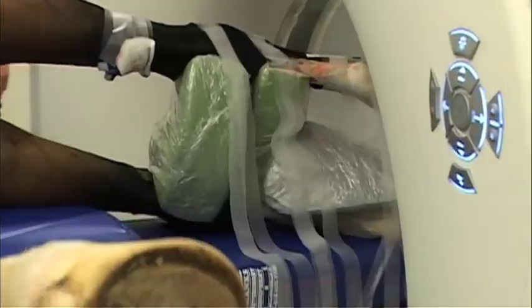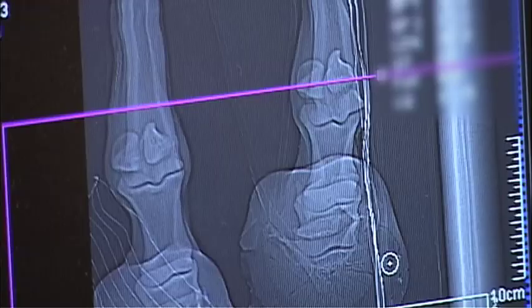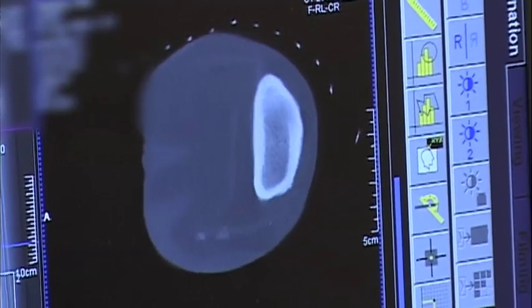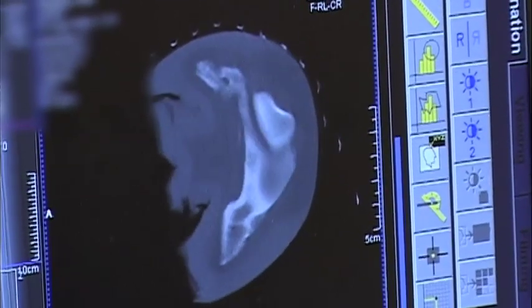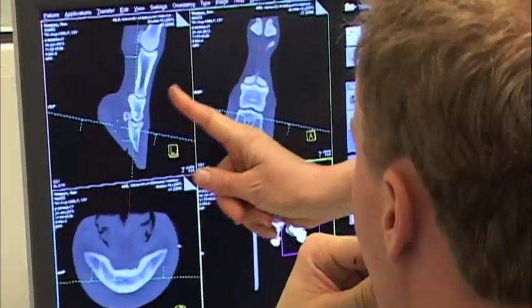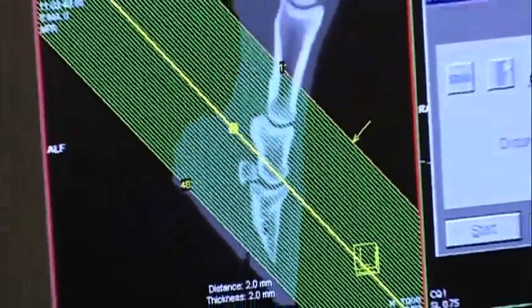The horse is rotated into the exact required position and the scan procedure begins. The carousel and horse are in perfect synchronization with the CT couch. Travel is smooth and precise. The carousel moves in unison with the couch movement, stepping in accordance with the procedure's set protocol. The automatic tracking ensures a series of accurate, precise scans.